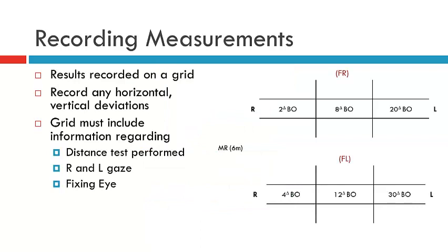Okay, in terms of recording it, it's exactly the same as we record the prism cover test in 9 positions. In this particular instance, I've given you an example where an orthoptist has elected to simply do primary position, right gaze and left gaze as being the only positions of particular interest.